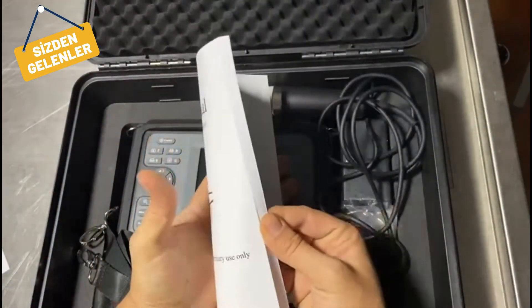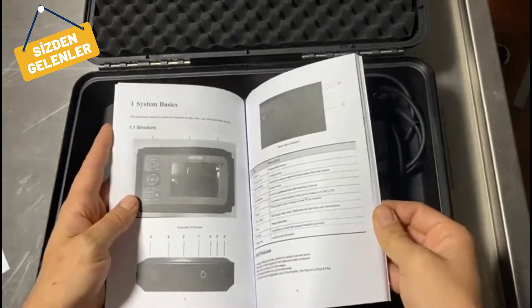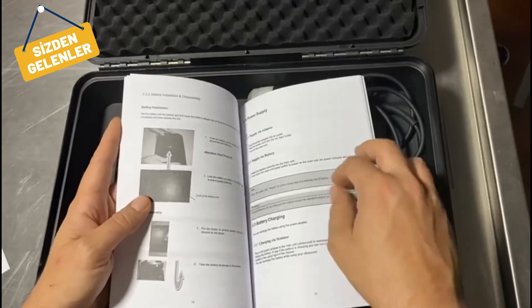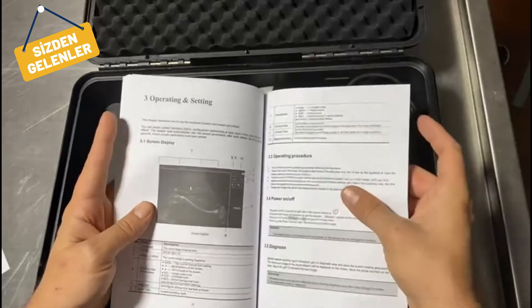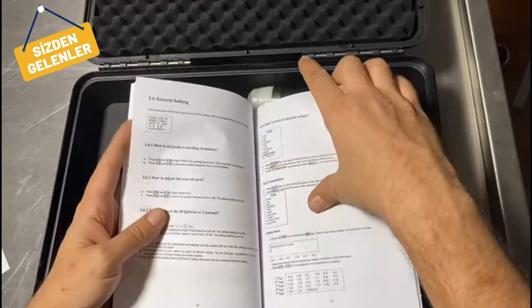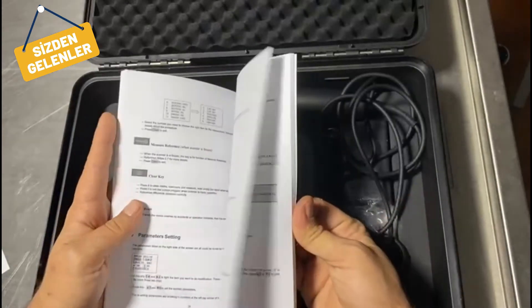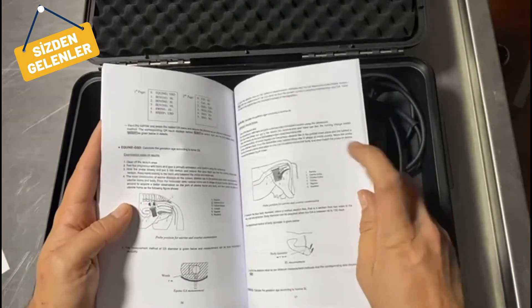First, the user manual. It contains all types of information about how to use the device, how to charge it, the menu interface, and also some quick tips about how to perform an ultrasound on horses and cattle.